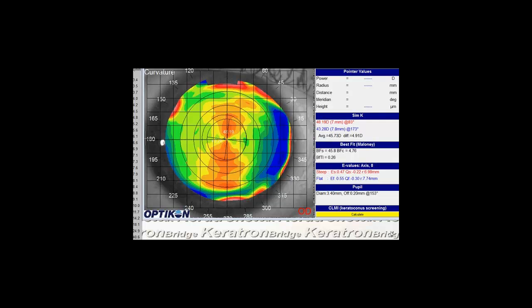Now that we've selected the diameter for this contact lens, we can move on to the proper design mode to use. So we're still analyzing the cornea itself. We haven't opened the software yet, but we want to know if we're going to design in RSIM, which is radial symmetric, GSIM, which is geometrically symmetric, or freeform, which is used for asymmetric corneas.